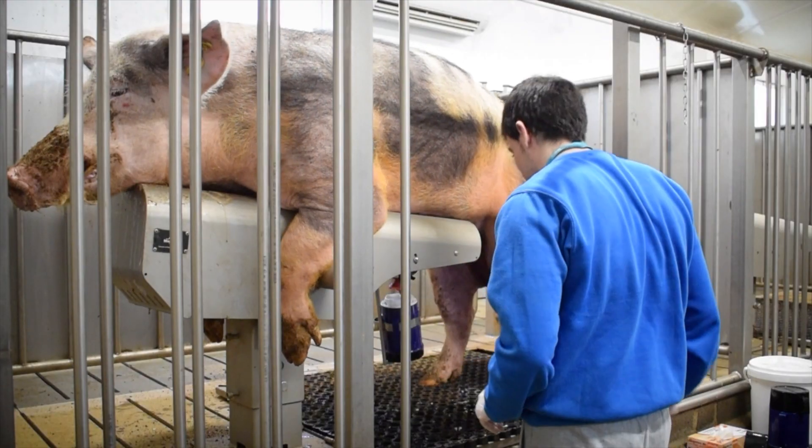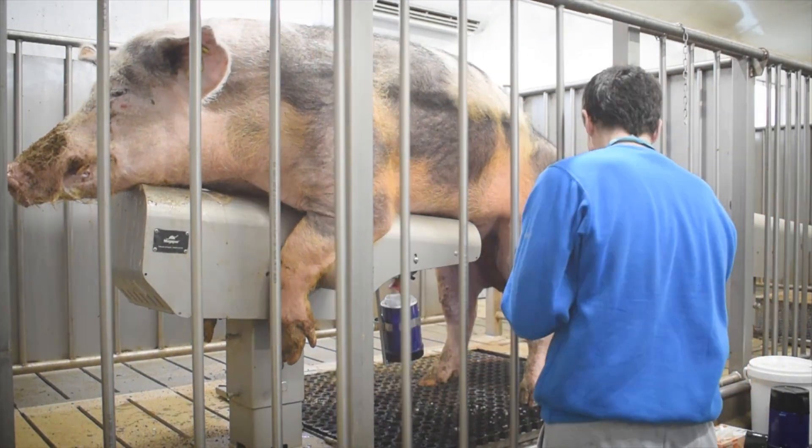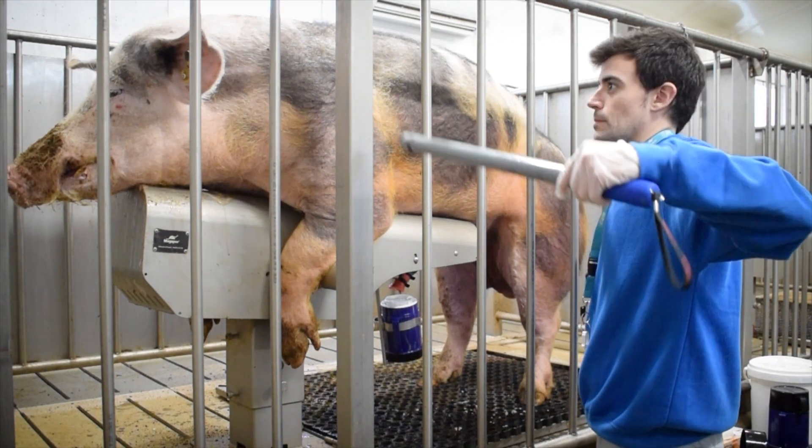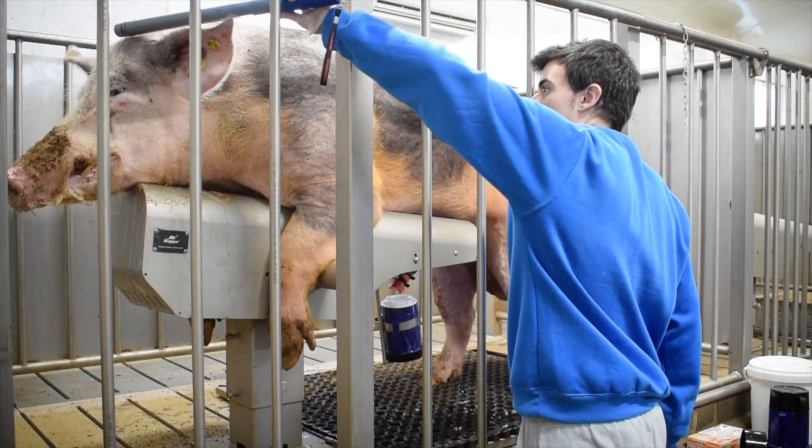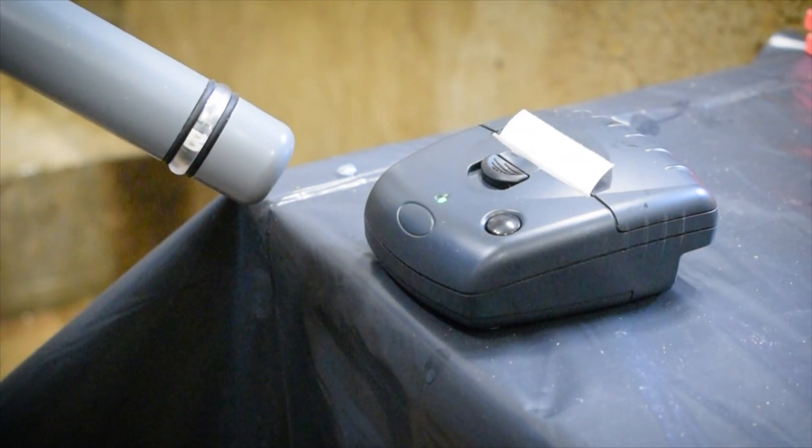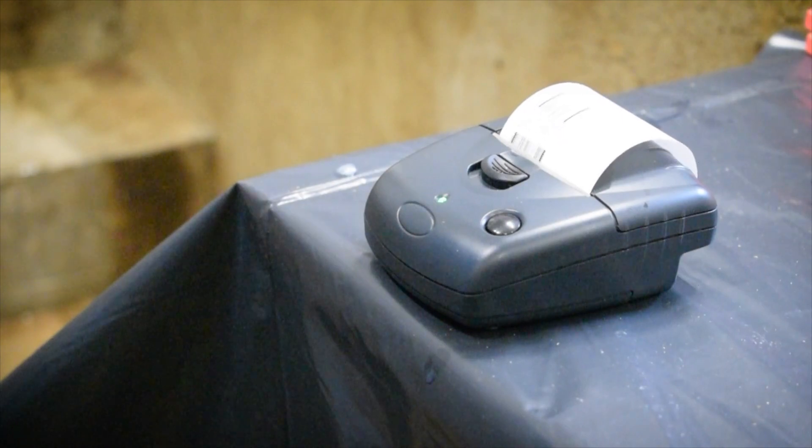With the GSP traceability system, the ejaculate is identified. The RFID technology reader allows the identification of the boar, the operator, the date, and the time in a fast and safe way. A Bluetooth printer prints the identification sticker.